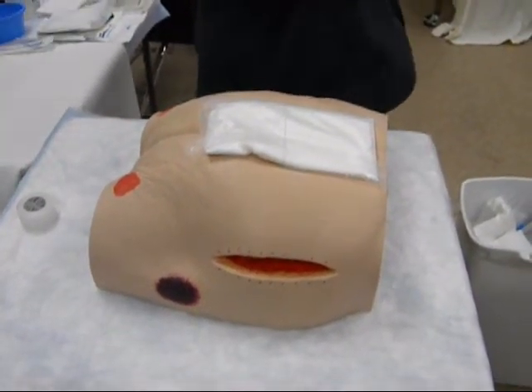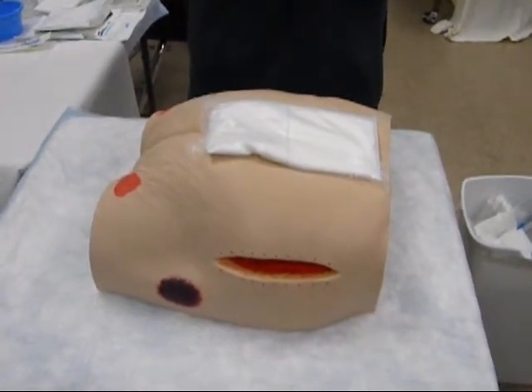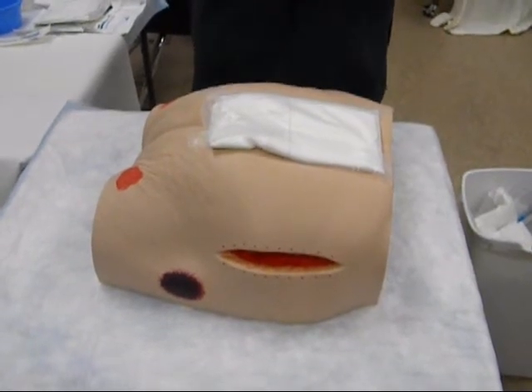The 4 stages in pressure ulcer formation relate to observable tissue damage. We are going to be demonstrating a stage 3 pressure ulcer today, dressing change replacement.